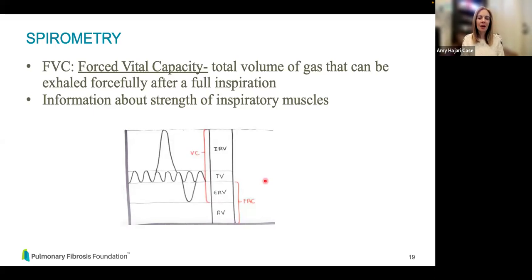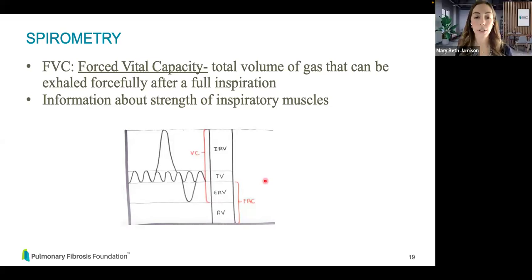So here's a question, and I'm going to ask it, but I'm going to frame it a little bit differently. The question asked was, can steroids change your test outcomes? And I'm going to change that on purpose to say, in what scenarios might use of steroids change outcomes of your test? Yeah, so if we're getting a pulmonary function test during someone's exacerbation, so say you're not feeling very good, and we evaluate that. We ask you, how were you feeling during the test? And you've not been feeling very good recently, and we need to give you a little bit of steroid for that exacerbation. Then we might see that FVC, that pulmonary function test, improve.